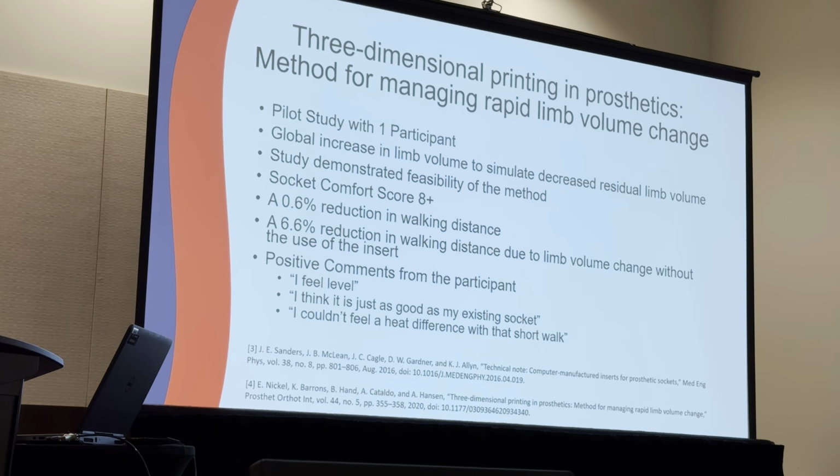The last point here is significant because obviously they're using a much larger socket than they would normally need to. This is a concern that we would like to keep monitoring in the future to see how it's affecting amputees and patients. Furthermore, more on the quantitative side, you can see that there was a significant benefit to using the insert, where we had a 6% improvement in the walking distance, or how comfortable they were walking with the insert socket system. Compared to the already existing good fitting socket, we had an insignificant less than 1% reduction in the walking distance compared between the well-fitted socket and the socket insert.